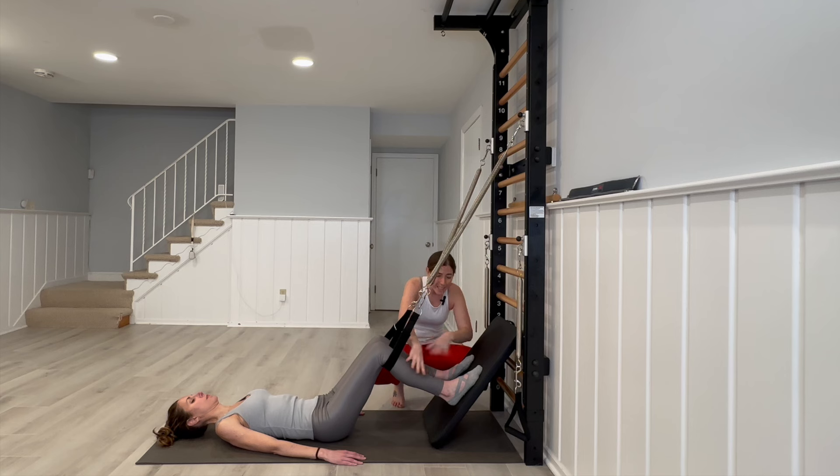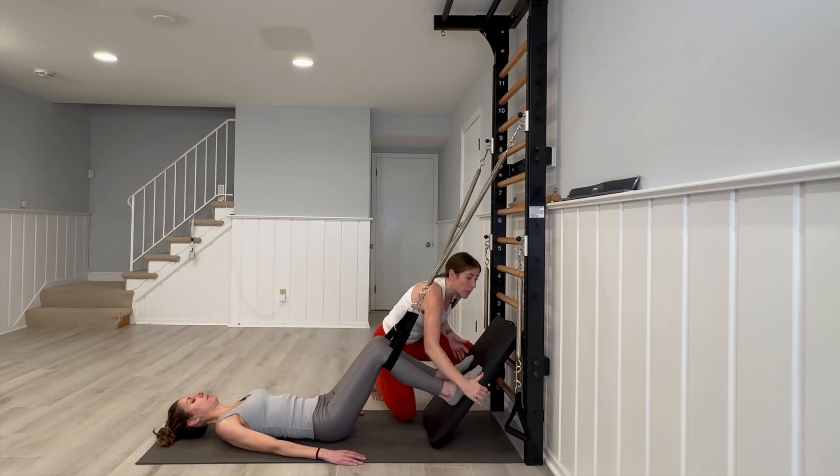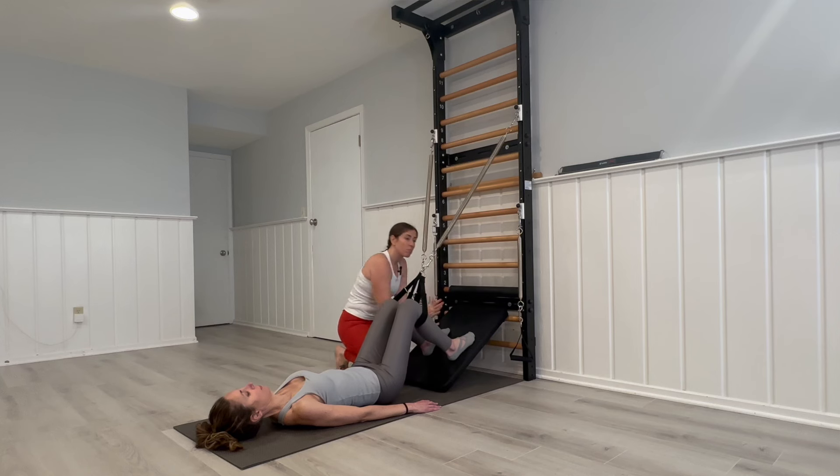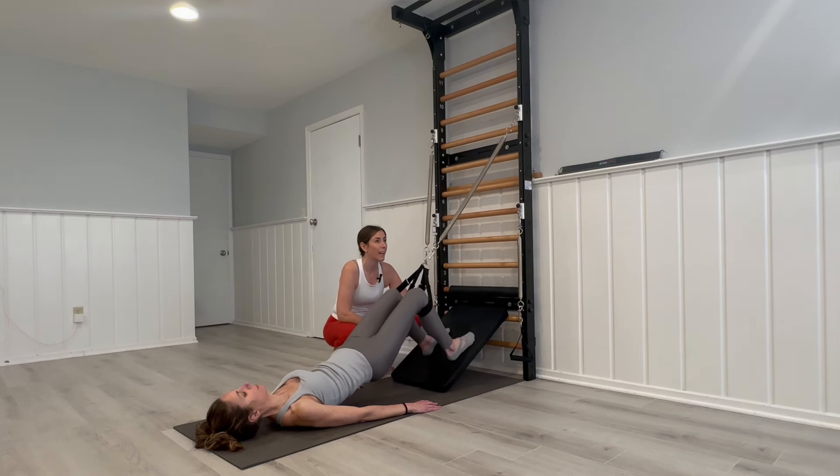You can vary the height to work on different ankle ranges of motion. A lot of our clients are so stiff and tight in the front of the leg — having their foot flat is not always ideal, so you can work them up and down. We can also take this down one notch to change the ankle position if needed.